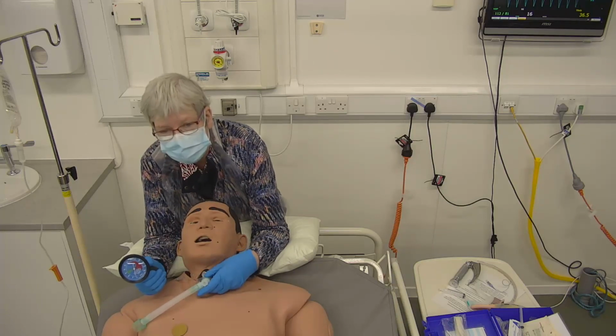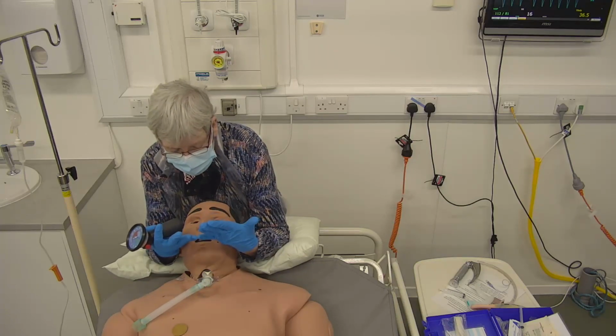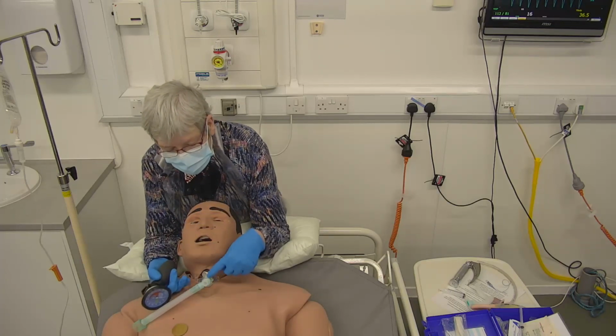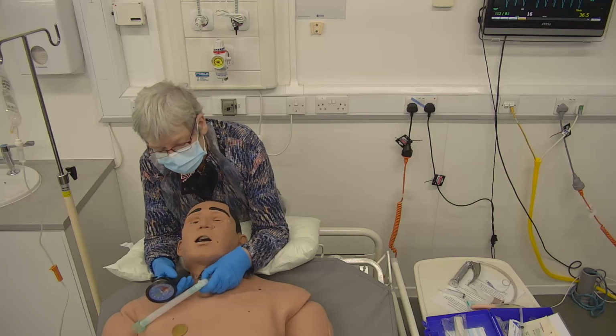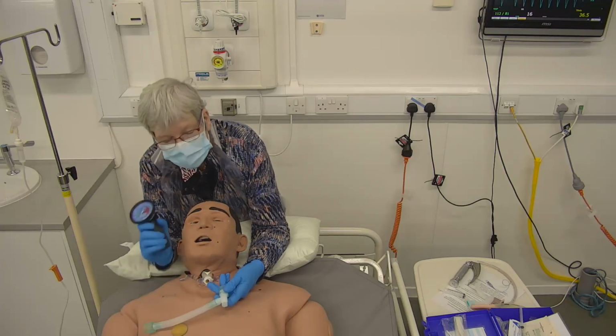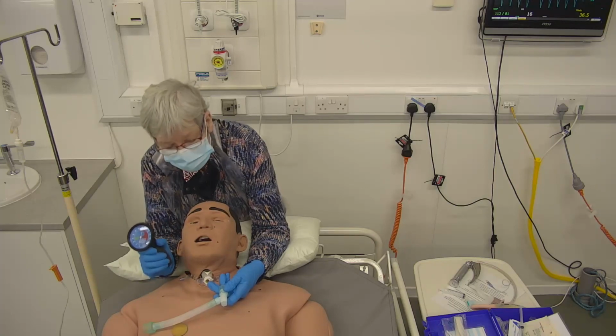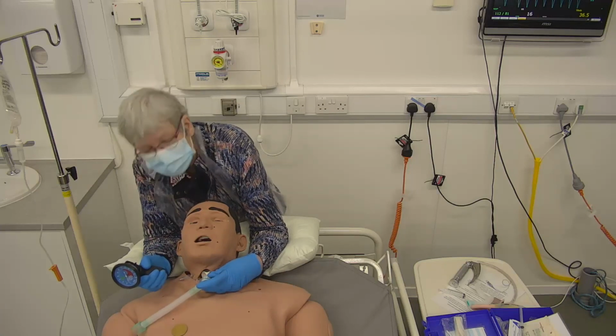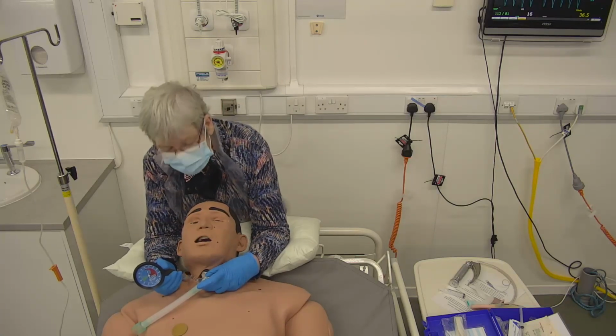It's very easy to suction when people have got either an endotracheal or a tracheostomy tube. All you do is you unhook and suction. If you're doing open suctioning, obviously with closed, then it becomes part of the circuit, and that is available in another video. All right, thank you.